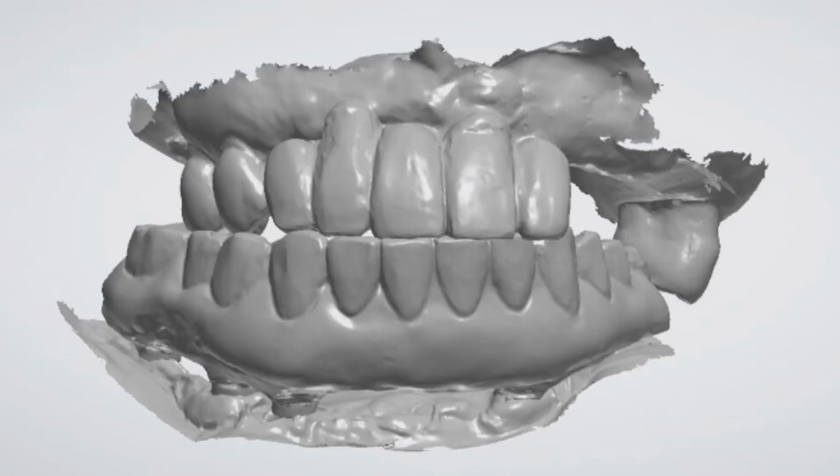You can get this intraoral image by scanning the provisional prosthesis, the opposite teeth, the edentulous ridge, and bite scan. Using the image, you can design the next one. After taking this intraoral image, the patient was discharged from the hospital.